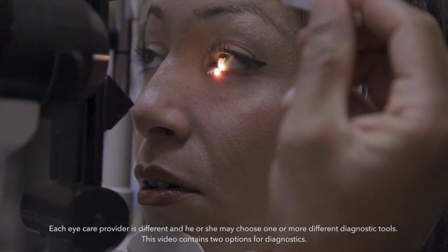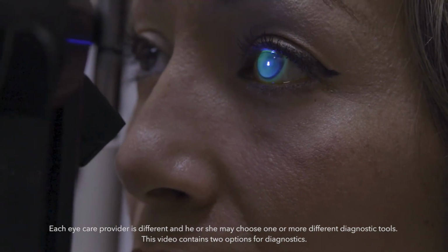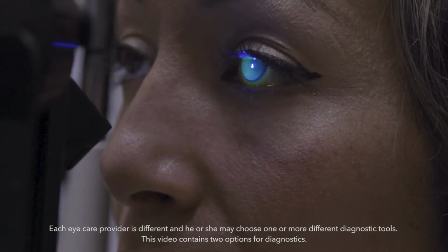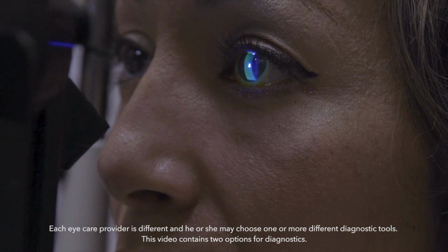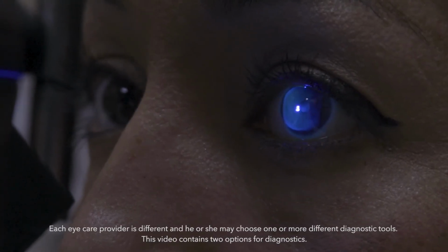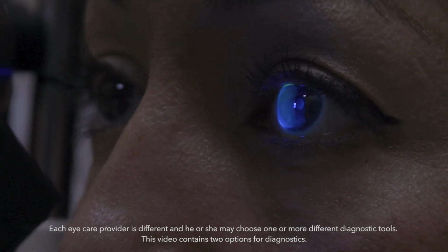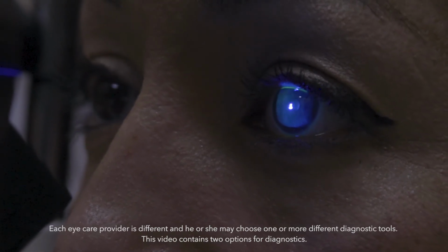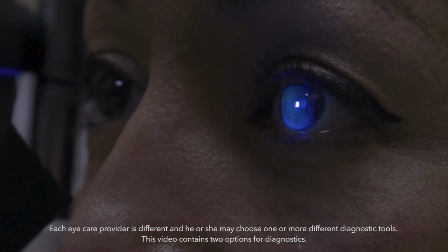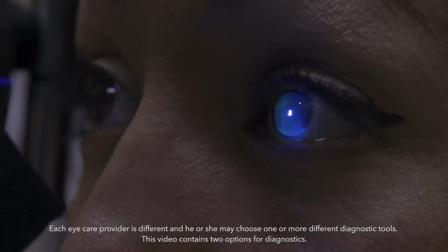Can I continue to blink or no? Yep, keep blinking. So you're going to spread the dye across the eye. We go to the blue. And then we just wait, and then blink, and then just look straight ahead. And we're just waiting for the fluorescein to break up. So it's starting to break up right about now. That was really painless. All I had to do is look out in the distance and keep my eyes from blinking. I could actually feel the dryness taking over and my tearing starts to flow. It was an interesting experience, but painless. That's the most important part, right?